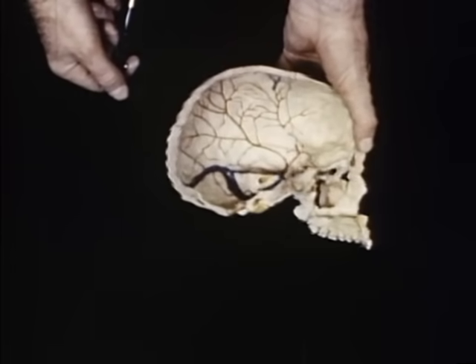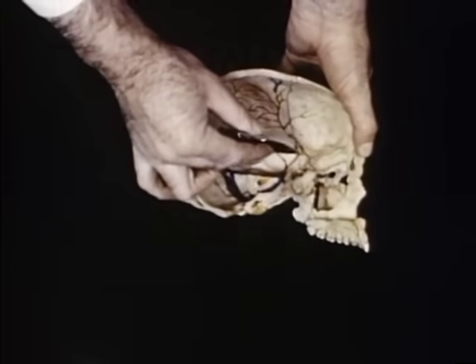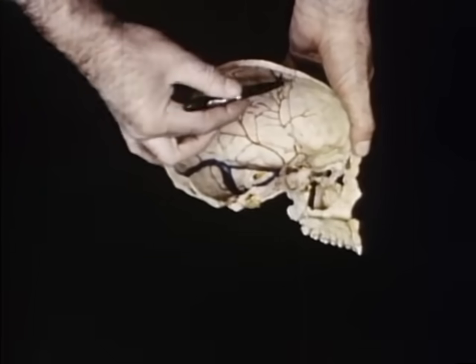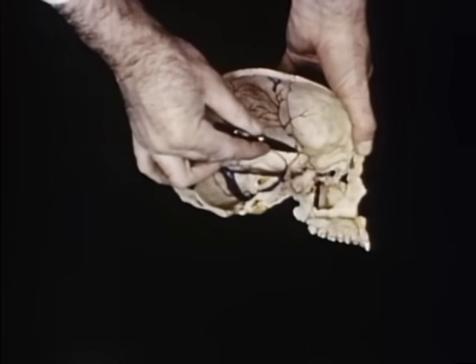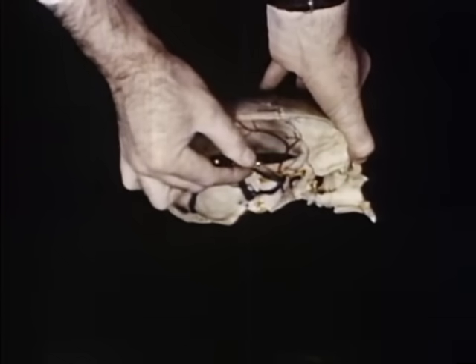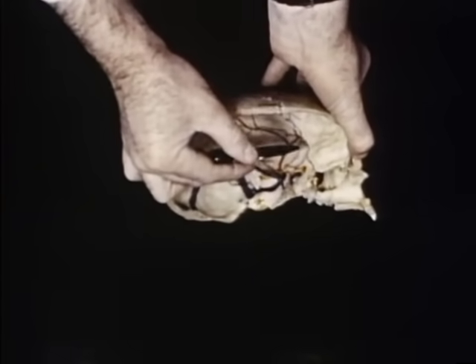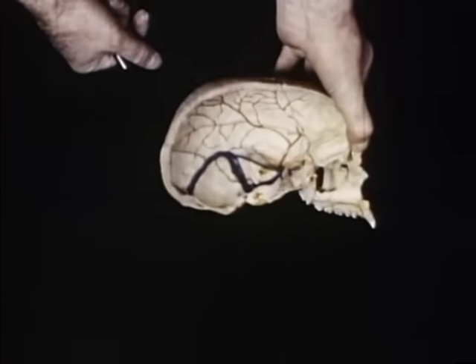The coronal suture on the inside of the skull is observed. Note again the sphenoidal ridge, behind which the operator must not penetrate for fear of lacerating arteries.